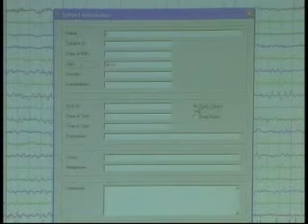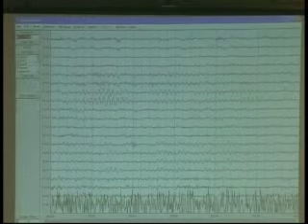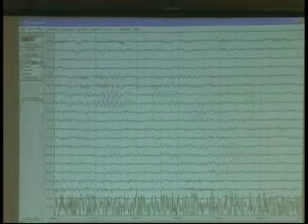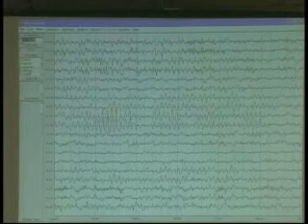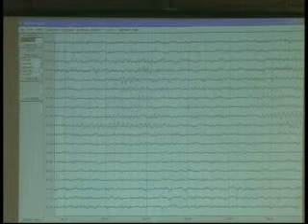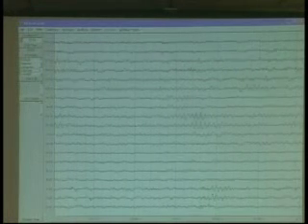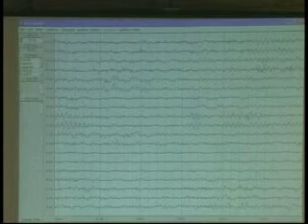So we're going to just tap in a letter for the name. We're going to pop the age in there, set eyes closed. You can fill in all the rest of this if you like. We're not going to bother — hit OK. There's our recording. I like to do EEG tracings in black, and I'm going to go for a linked ears reference, just like that. Here's a standard montage. I'm going to raise the scale up a little bit so the records are just a little smaller, and I invite people to look at these recordings. These are very good EEG tracings — they have all the details people are accustomed to looking at. You can see the alpha waves waxing and waning. Always use visual inspection to ensure that the records are reasonable. We see the beta activity up front and the alpha activity. Looking through this entire record, we see it looks very clean — I don't see any artifacts.